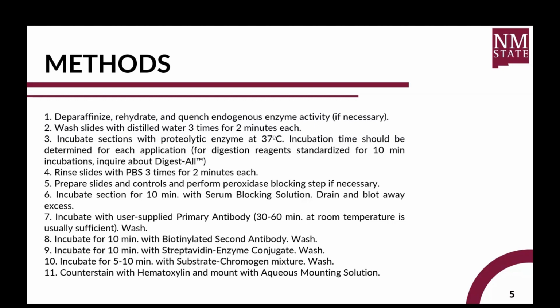Next, we must incubate sections with proteolytic enzyme at 37 degrees. The incubation time should be determined for each application. This step will ensure that we're ridding ourselves from any enzyme activity inside of the tissue. Afterwards, we must rinse our slides with PBS 3 times for 2 minutes each. PBS stands for phosphate buffer solution.